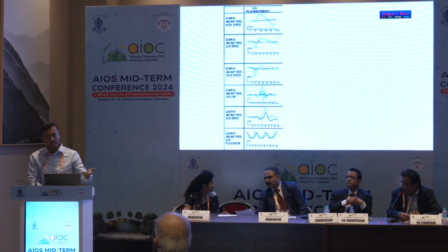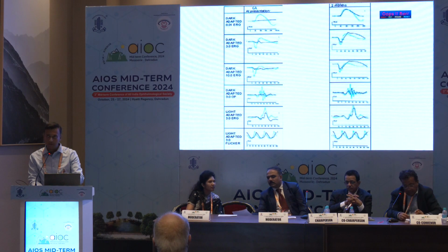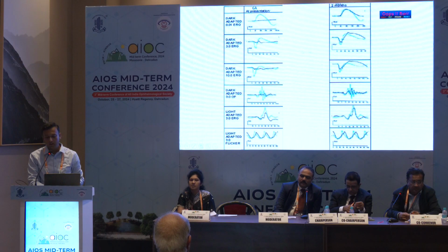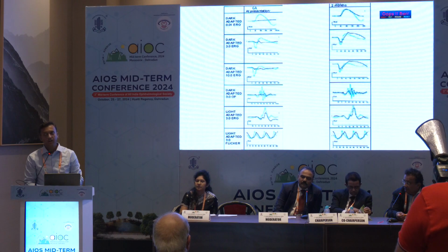Treatment is simple. You just start vitamin A supplementation, and this is the repeat ERG after 2 months, and you see all the rod waveforms have picked up very beautifully. So this is how we can utilize ERG and EOG.